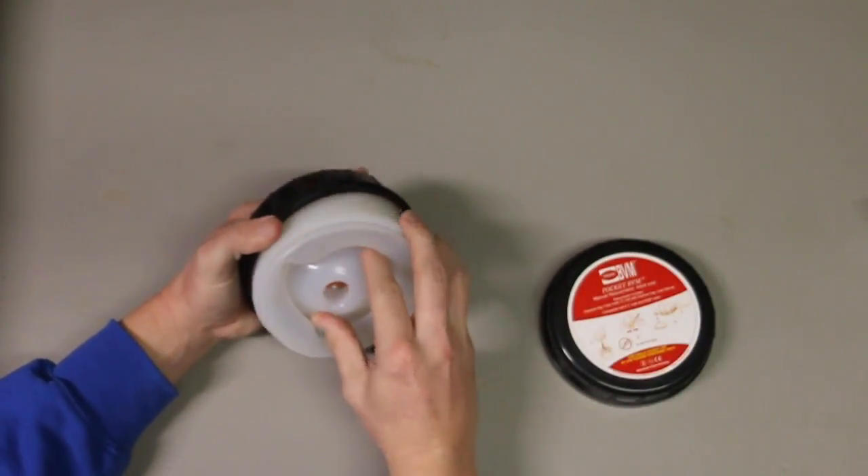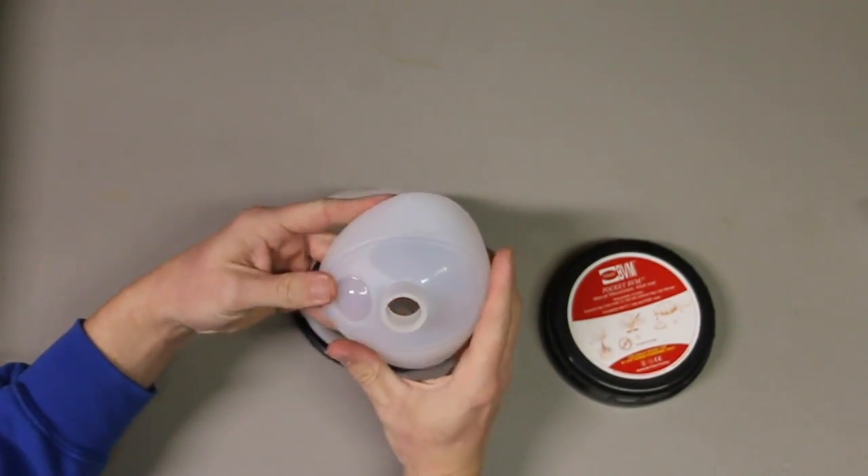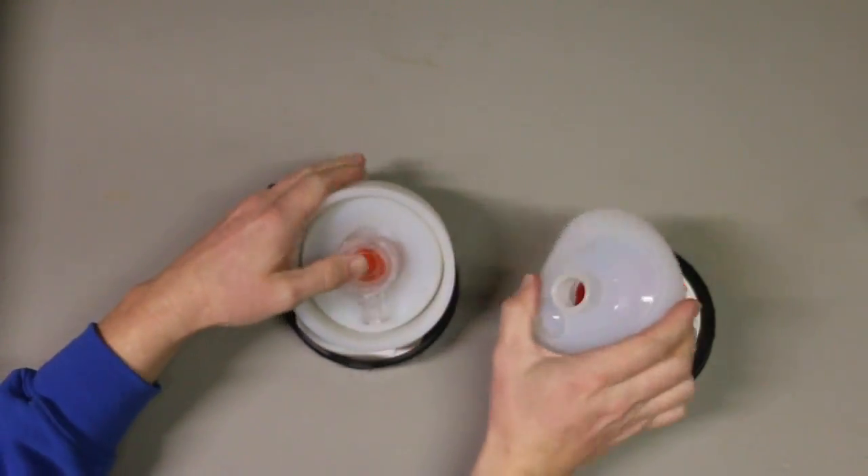So we open it up. This is our face shield here. This one goes over the patient's nose and mouth.